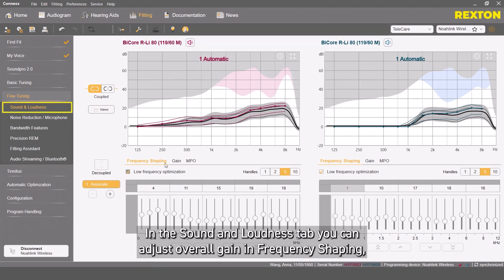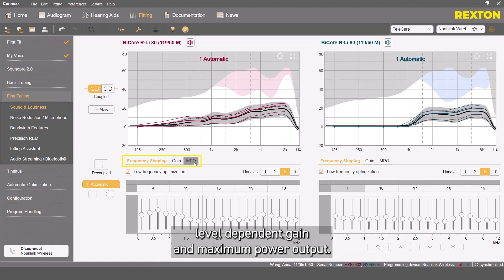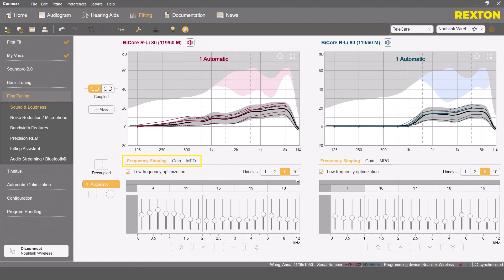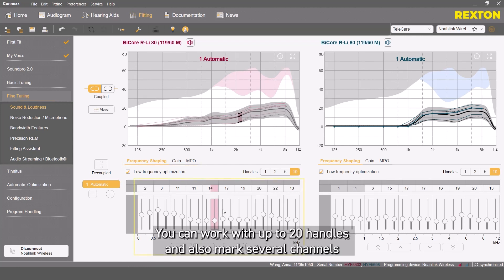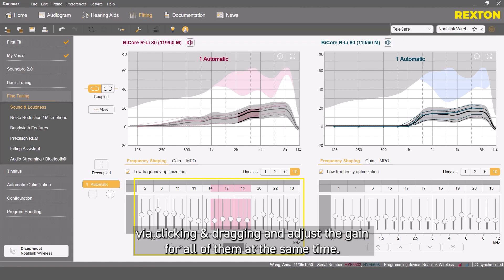In the Sound and Loudness tab, you can adjust overall gain in frequency shaping, level-dependent gain, and maximum power output. You can work with up to 20 handles and also mark several channels via clicking and dragging, and adjust the gain for all of them at the same time.